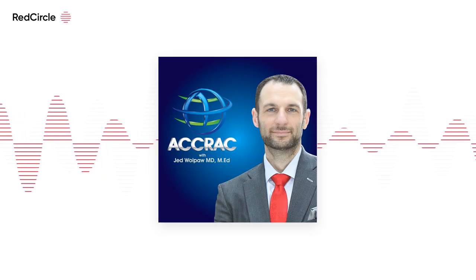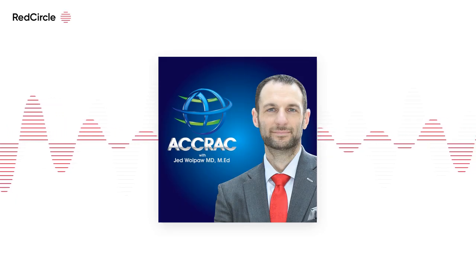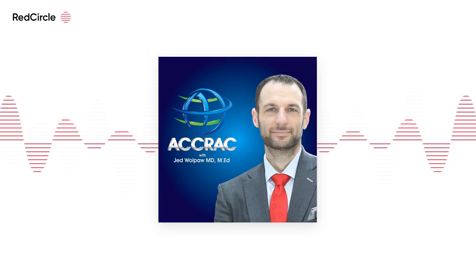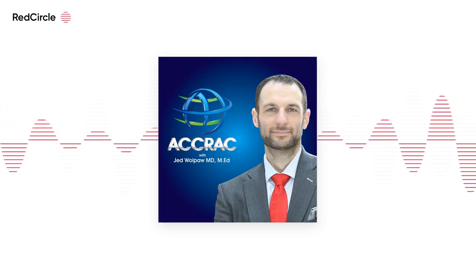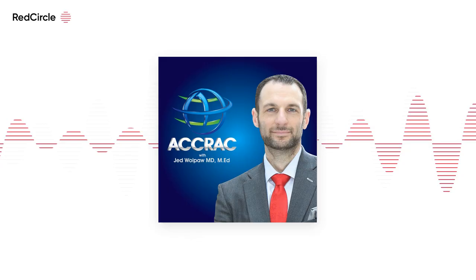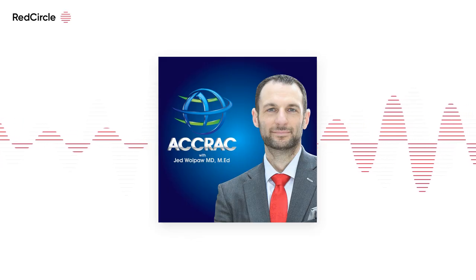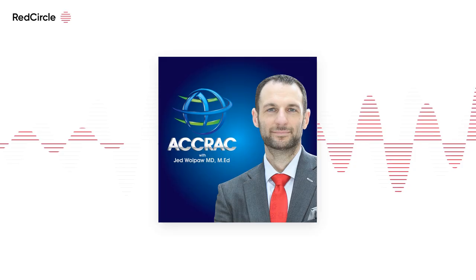Well, that's what I find interesting about EIT. Unlike most of these other techniques that are lumping the whole lung together, it starts to allow you to be more heterogeneous and see how individual portions of the lung respond to certain things, not just geographically, but also over time during the breath. Are there changes in inflation during inspiration, and things like pendelluft, that you would have no idea about because everything else was like, oh, what does the lung look like at the end of inspiration? And that's that. So I think still an evolving area, but super interesting.